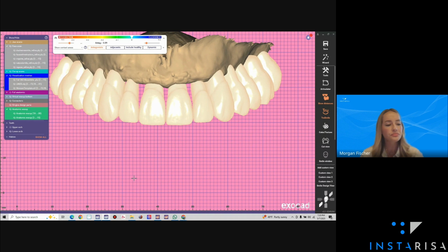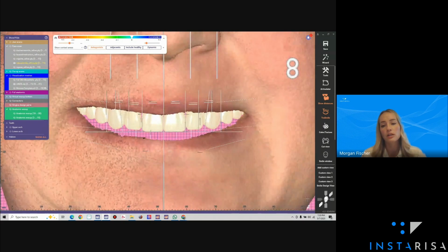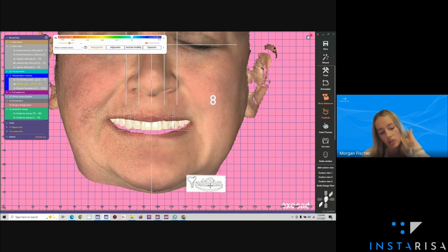lines in the back. Next thing I'm looking at is my interdental proportions. That's step number 3. So we're going to use golden ratio for the most part on these patients unless otherwise requested by the doctor. So these are my golden proportion grid lines here. And then the next is we're always setting our central incisor position.